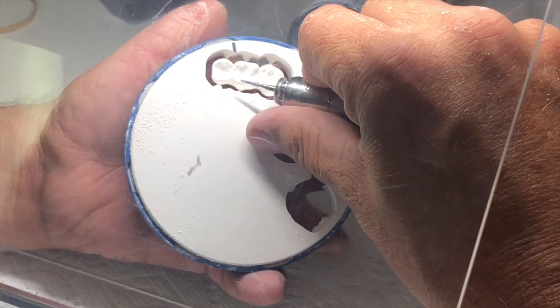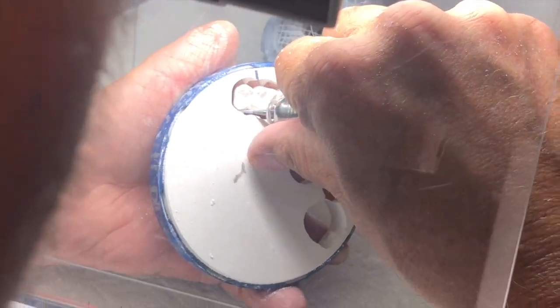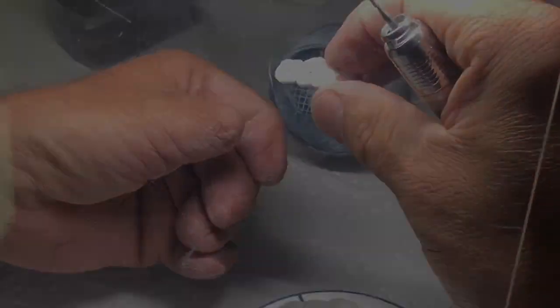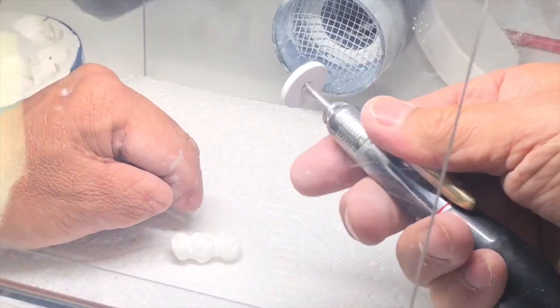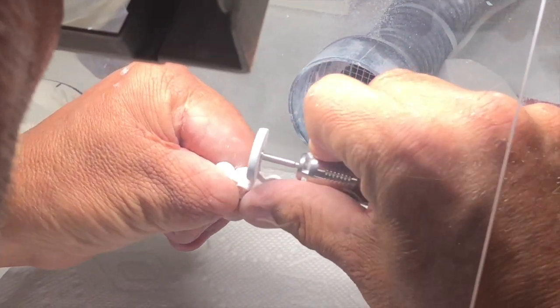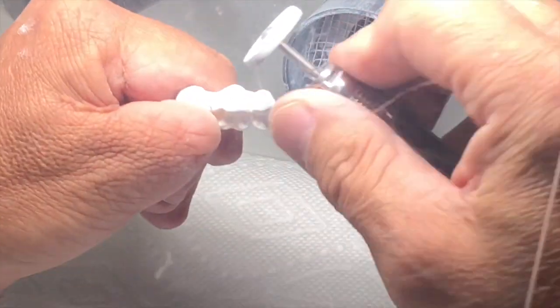I would take that burr — or you could use a 557 carbide burr — and cut off the sprues. Some of them will break, but it won't mess up the restoration. Then I take my silicone wheel and I will bulk trim down all of the sprues, and if I have any bulk areas I need to take down, I will use this wheel to do that.